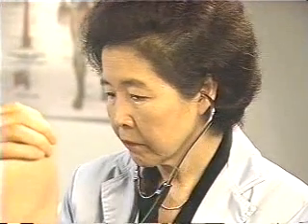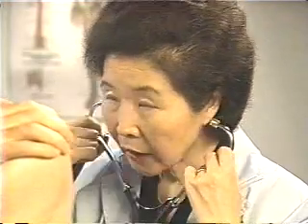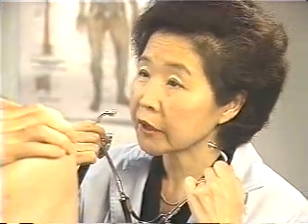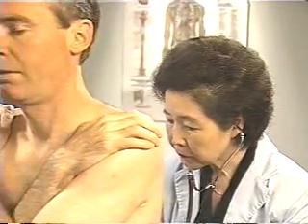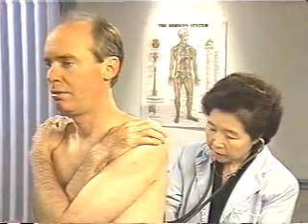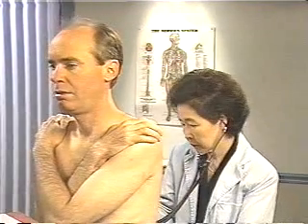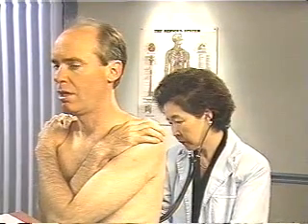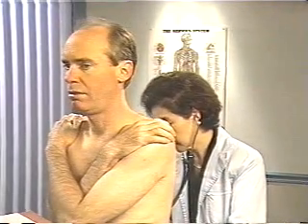If you hear bronchial or bronchovesicular breath sounds where they should not be, listen for transmitted voice sounds. Ask the patient to say 99. Voice sounds that are louder and clearer than normal are called bronchophony.